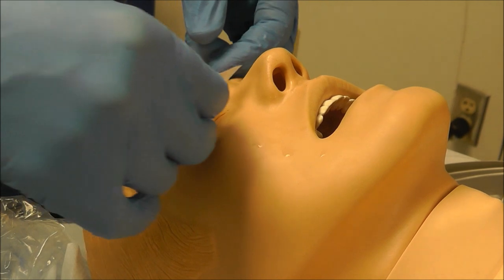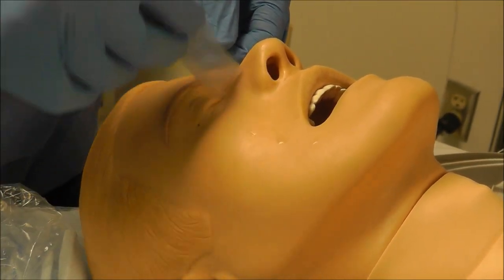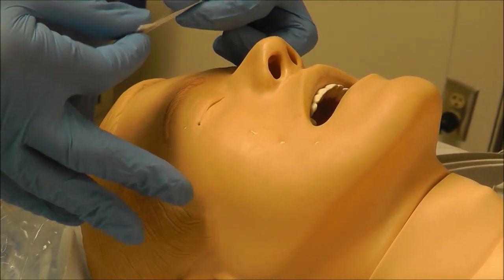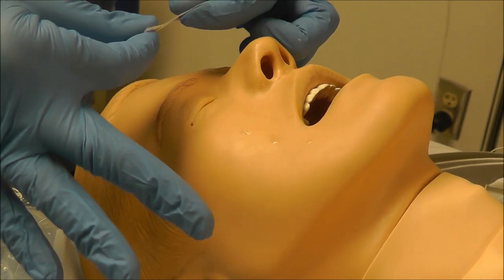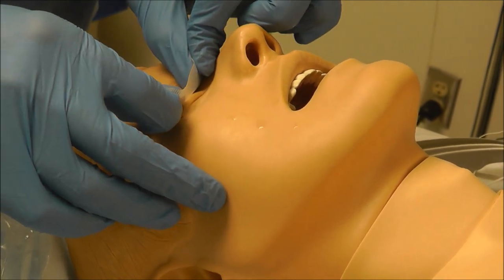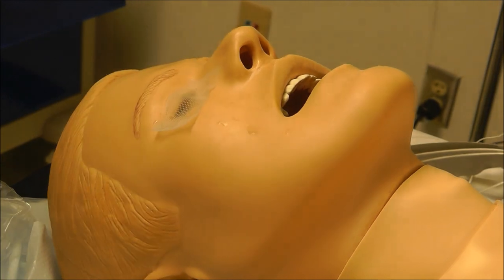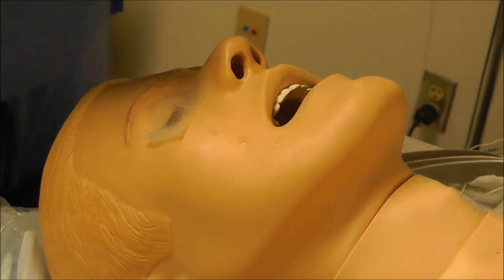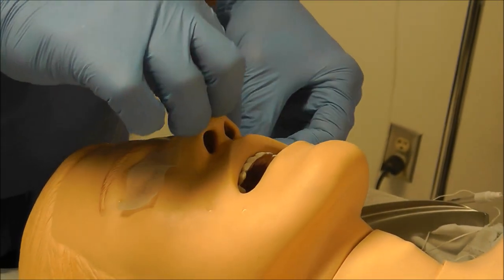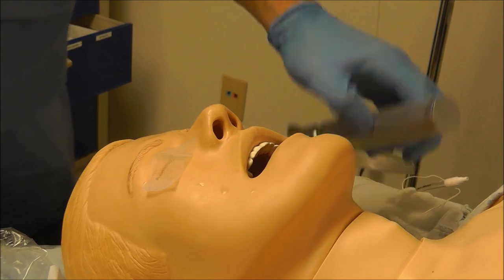You don't want to just stick eye tape on carelessly. The correct way to put on eye tape is to use both hands to grab the upper eyelid and push it down over the bottom eyelid. Then we do it with both eyes, and now we can go ahead and intubate.